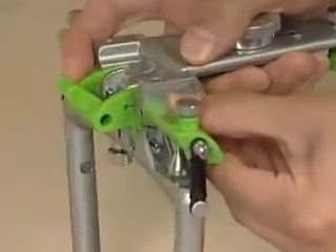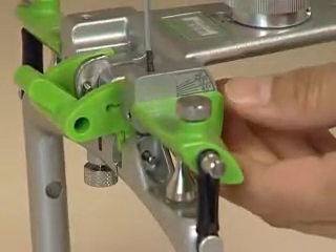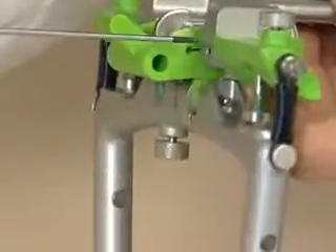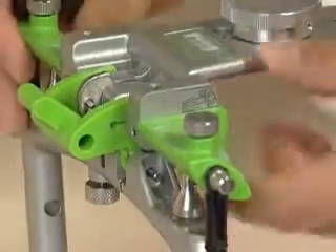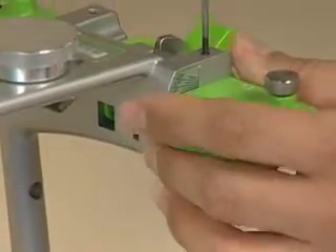Use the wrench and loosen both of them. You have to release both of the allen head screws in order to set the analogs, and then re-tighten those screws in order to hold the analogs in place.